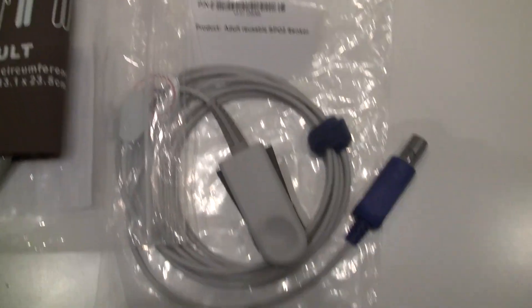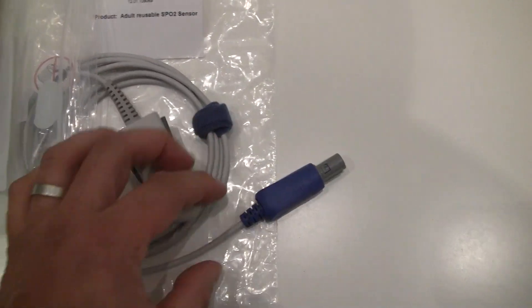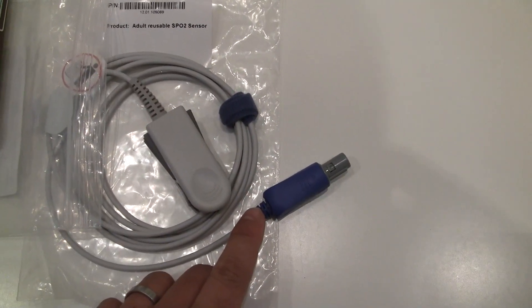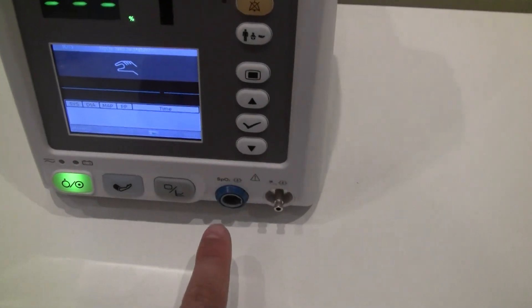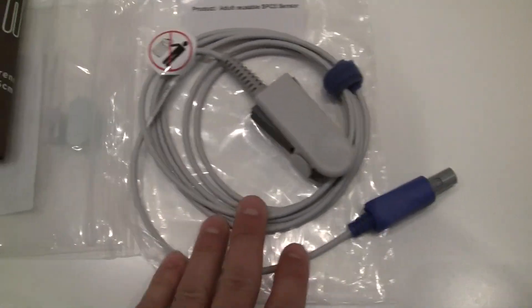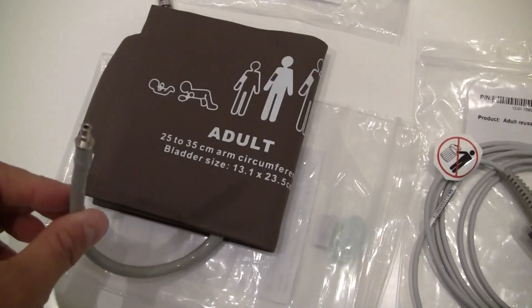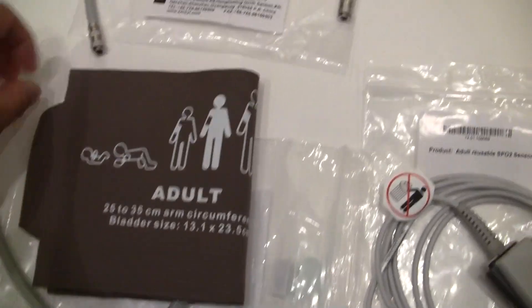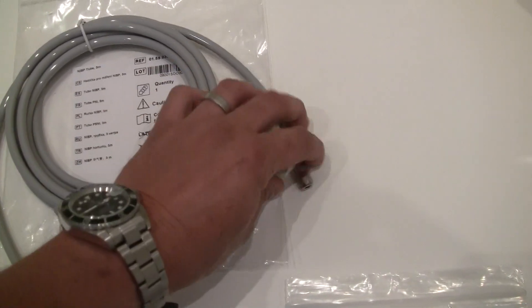As for accessories, the unit comes with an adult size SPO2 sensor with a round limo style connector. There is an extension cable that converts the limo connector on the machine's port and terminates into a square DB9 connector, allowing you to use a Nellcor compatible SPO2 sensor. It also comes with a standard adult large NIBP cuff with bayonet style connections and NIBP tubing with the same bayonet style connectors.